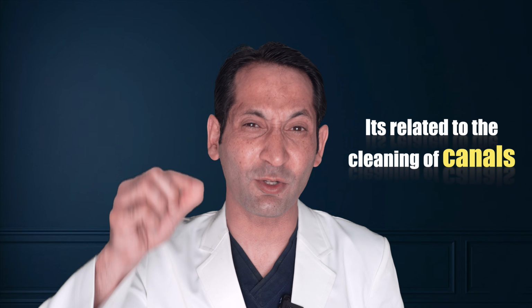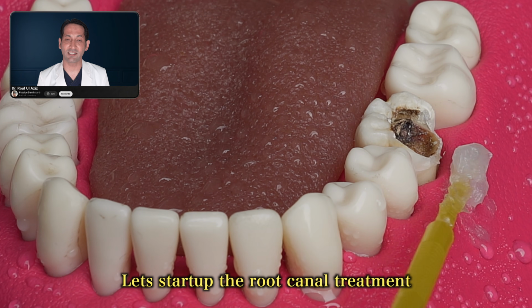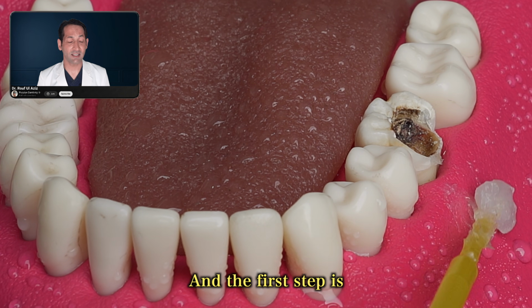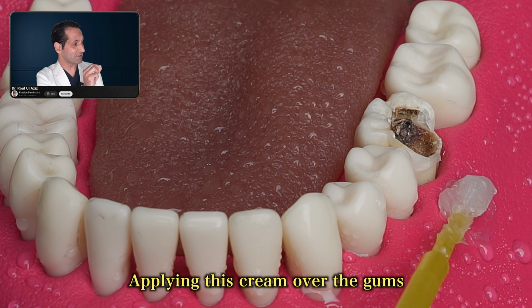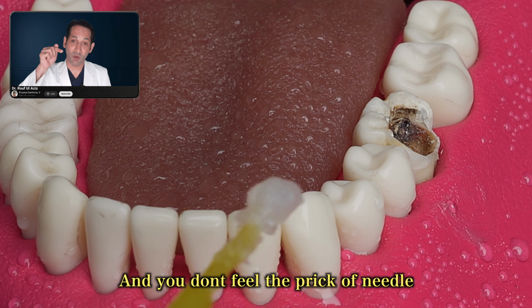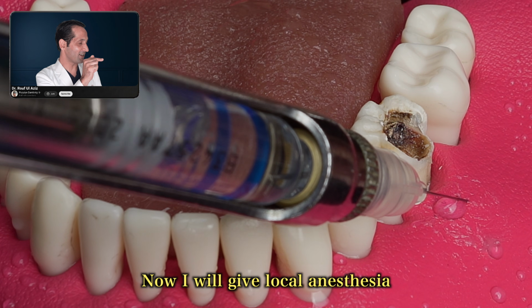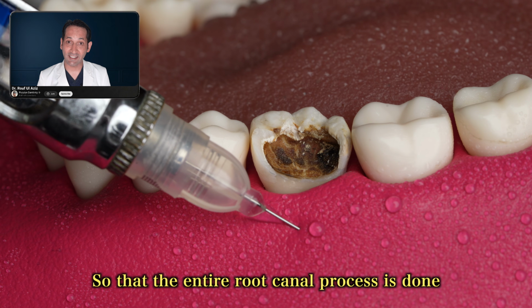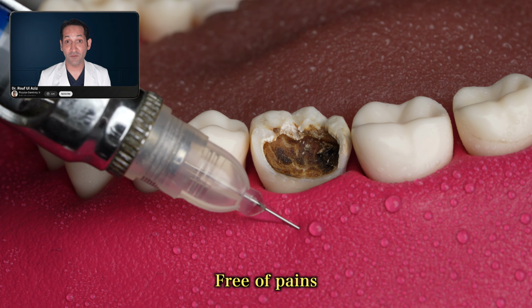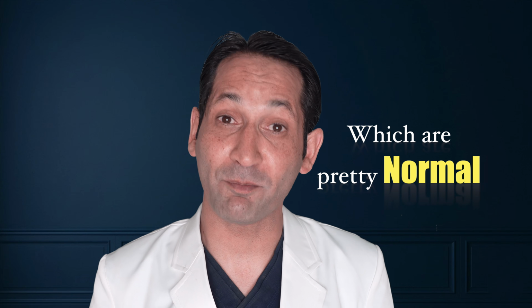Okay, clear? The purpose of root canal is related to the cleaning of canals. Now without wasting time, let's start off the root canal treatment. The first step is applying this cream over the gums. It numbs your gums and you don't feel a prick of needle while injecting local anesthesia. Now I will give local anesthesia comfortably so that the entire root canal process is done free of pain, zero pain. You may feel slight discomforts which are pretty normal.